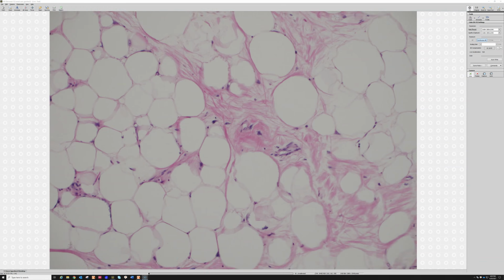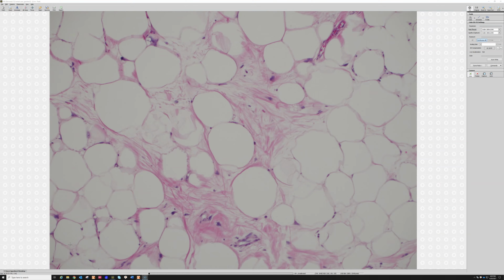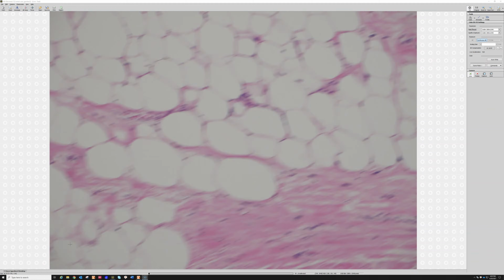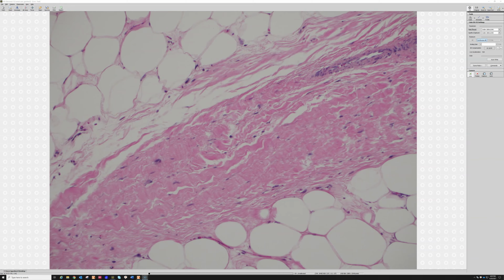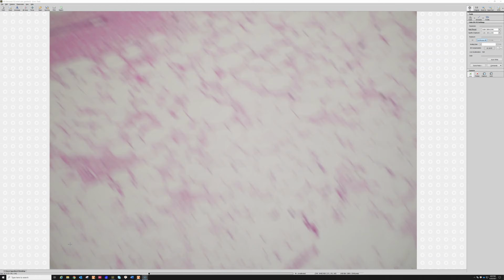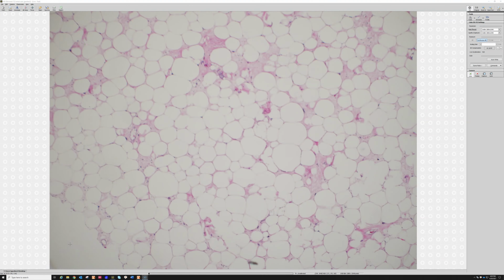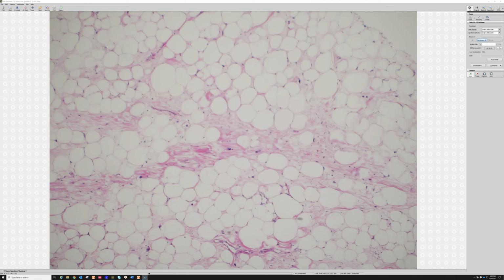So if you're looking at a fatty tumor and you're seeing some sclerotic stuff but can't find atypia, and it's a large mass and you're worried about it from the clinical perspective, then go hunt around the blood vessels and see if you can find any of the hyperchromasia in the collagen-rich areas right around the vasculature of the tumor. That can be a helpful hint sometimes. Another tip that I gratuitously stole from my wonderful mentor, Sharon Weiss.